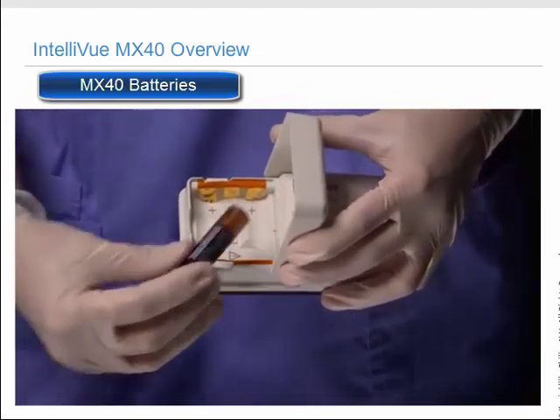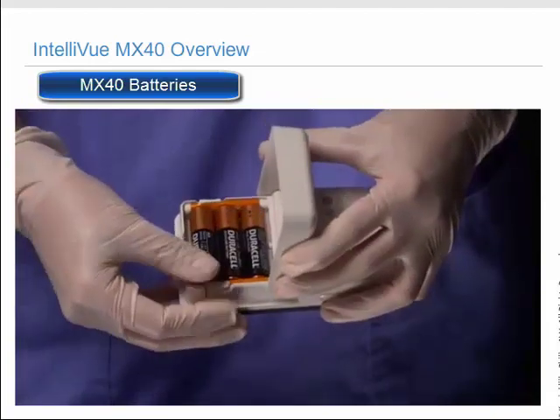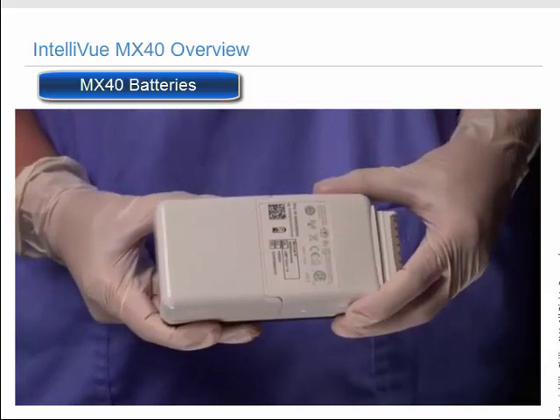3 AA batteries are used in the MX40. You notice that all 3 AA batteries are placed into the compartment the same way. Once you put your batteries into the MX40, you have turned the device on.